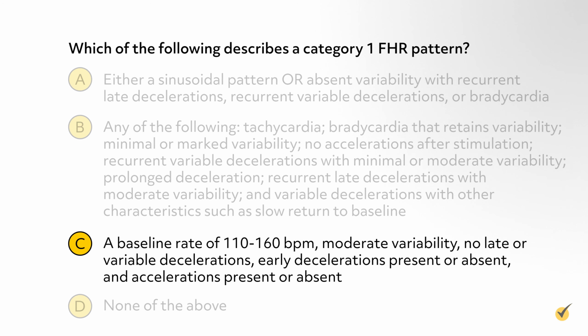If you chose C, you're correct. Category 1 patterns are considered normal and no intervention is necessary.